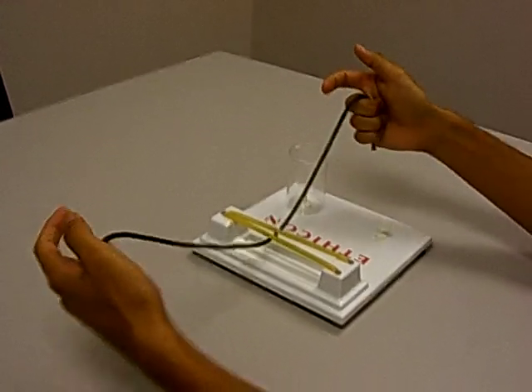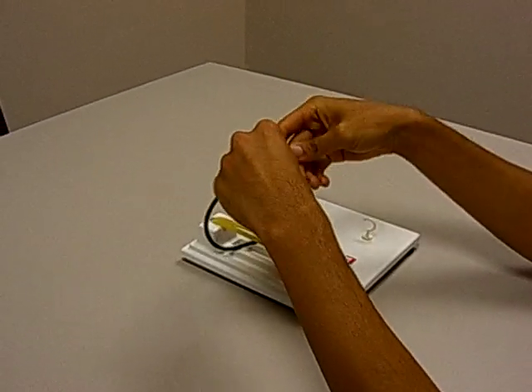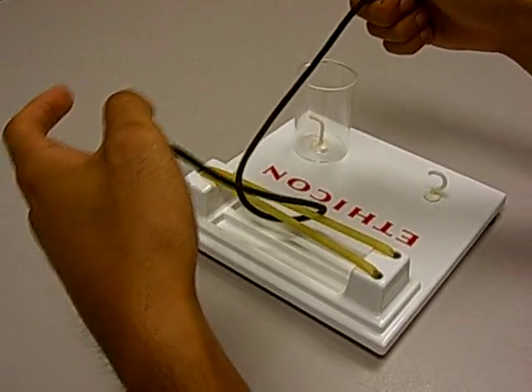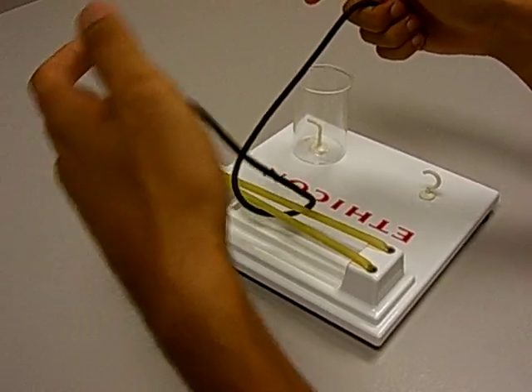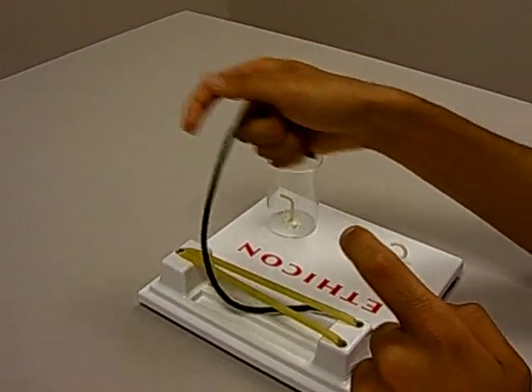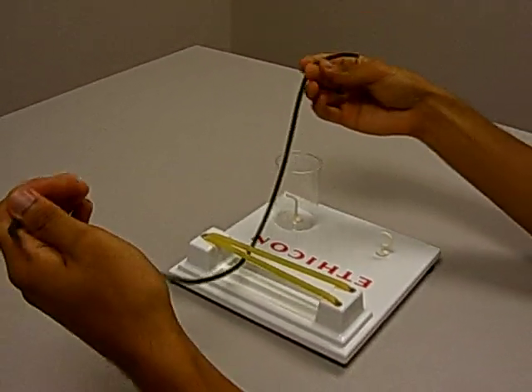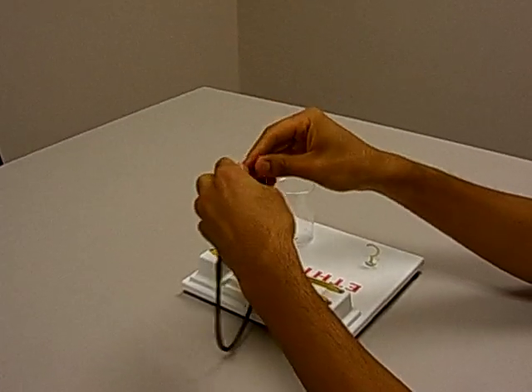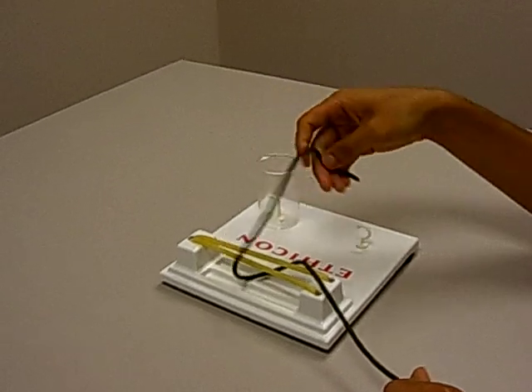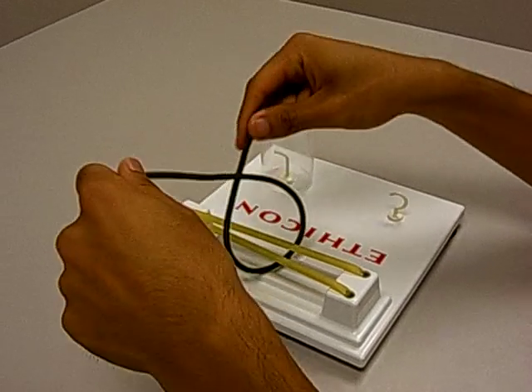For your starting position, you don't want to start like this — this is wrong. You want to cross your strings, and then make sure your left hand is holding the left string, the string on the left side, closer to your body. The string on your right side should be further away from your body.